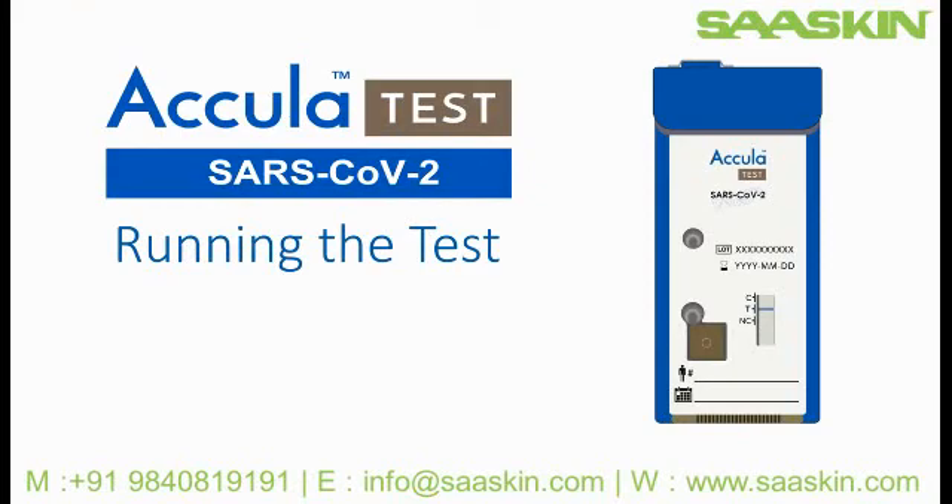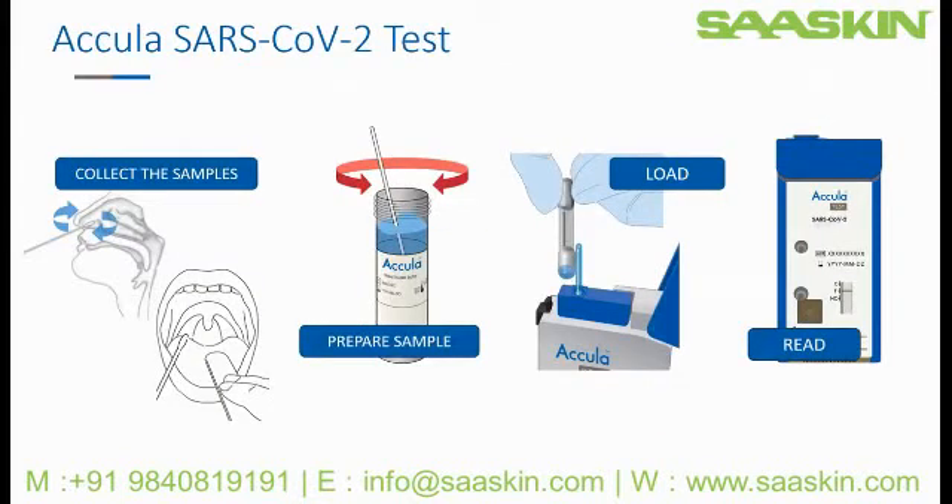Welcome to this training video on running the Acula SARS-CoV-2 test. This video will cover loading the prepared patient sample into the test cassette and initiating an assay. You should have already watched the training on collecting and preparing the patient samples. A subsequent video will explain reading the results.